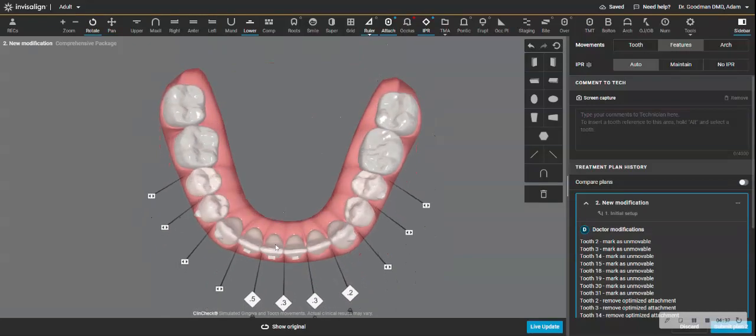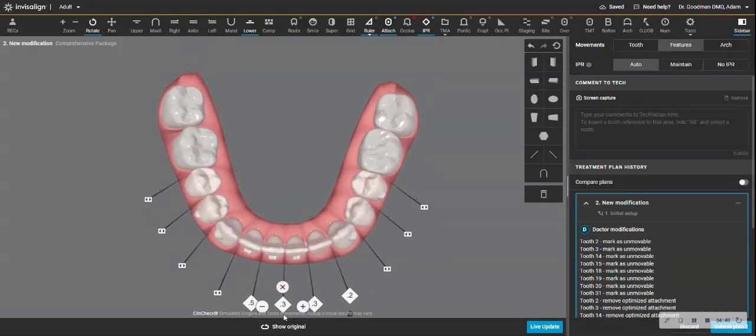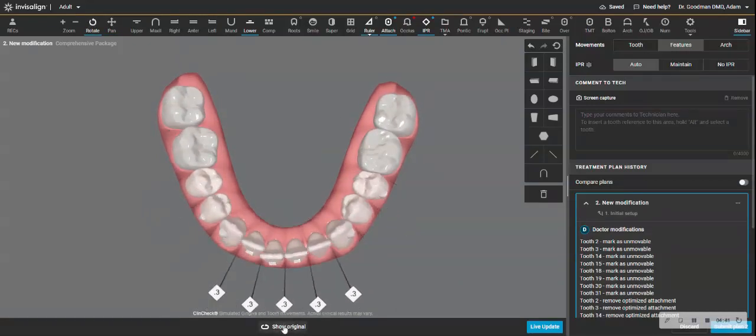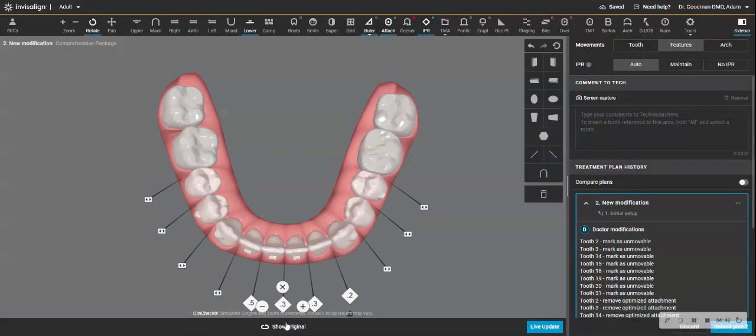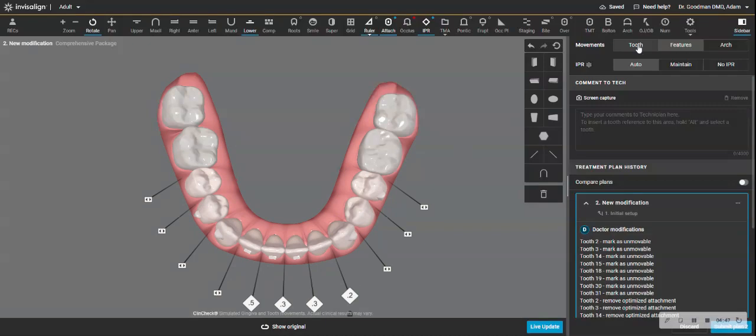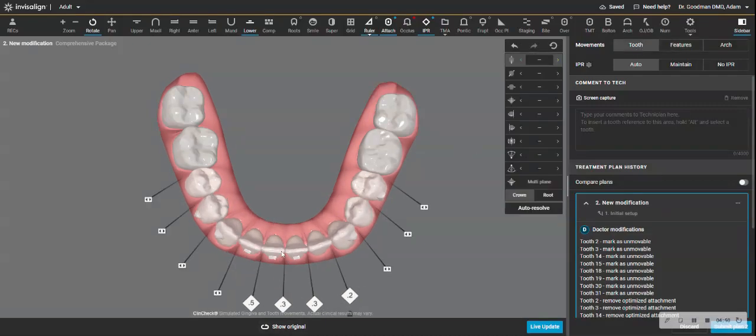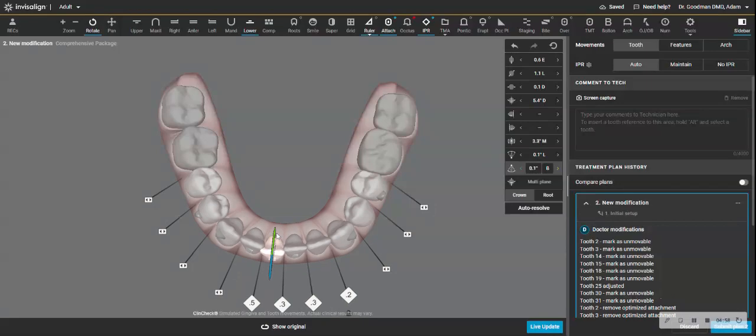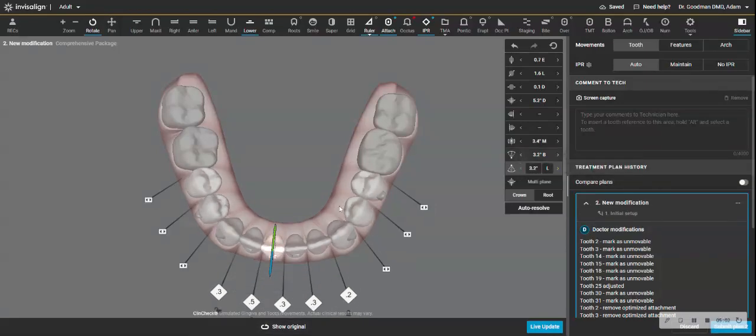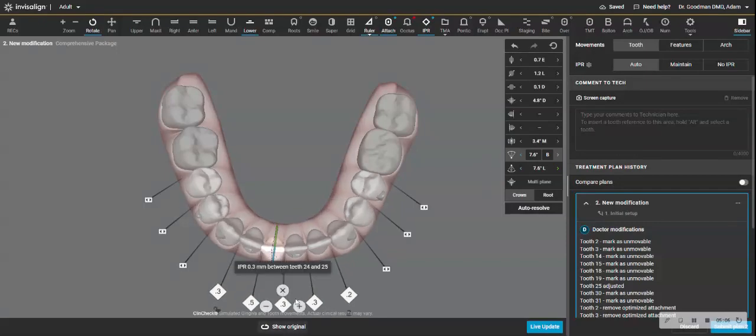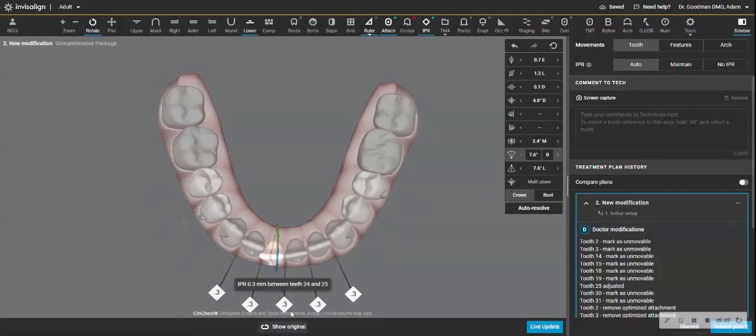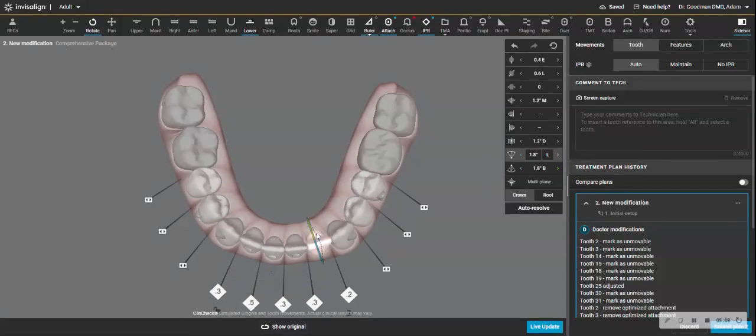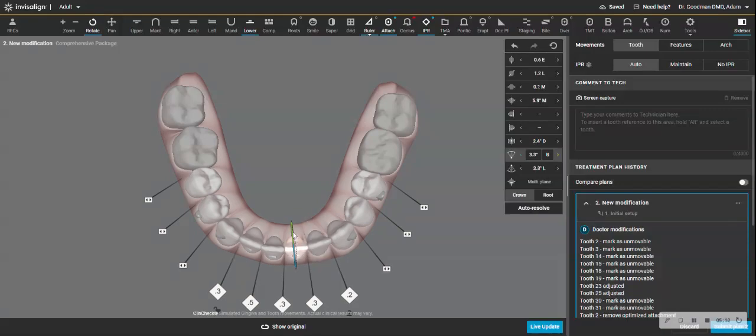Let's just see how these teeth are being moved. All right. Now, look at how the cingulum area, number 25, is moving in almost bodily. But that's nice on paper, on computer, but it doesn't really work that well in the mouth. I would rather the tooth move with a more predictable type of tip. So what I'm going to do is actually remove some of that lingual root torque. And I'm seeing it everywhere. And I'm okay.